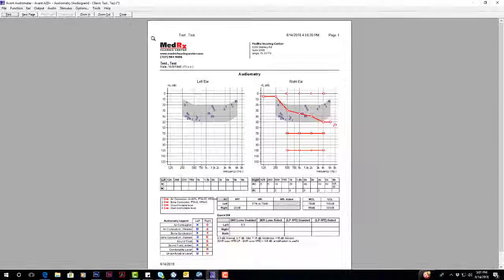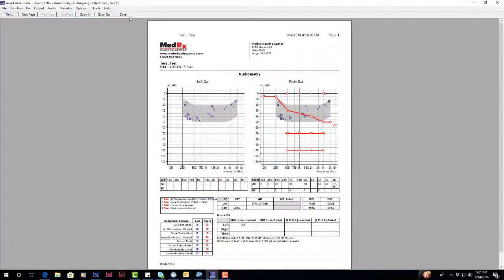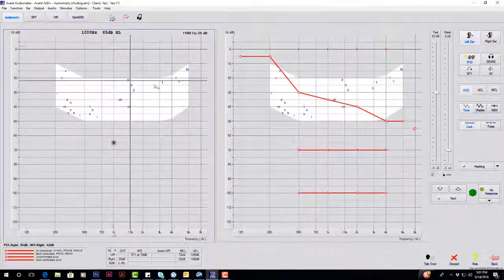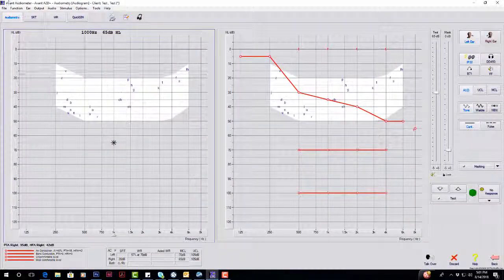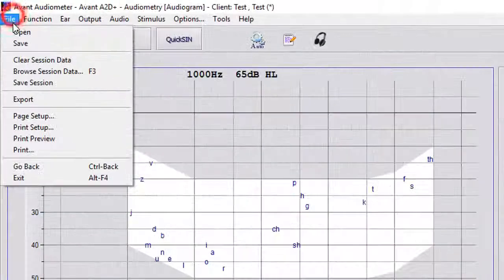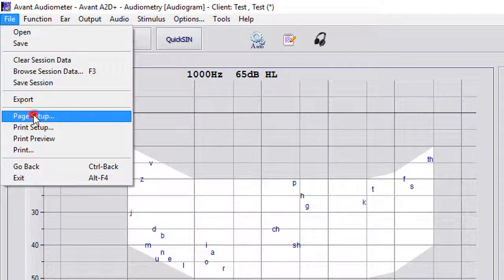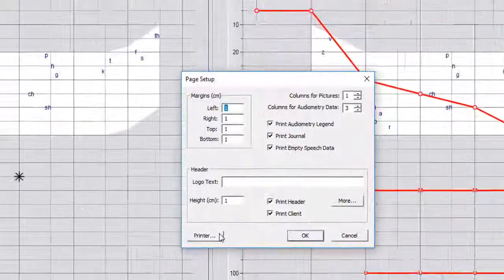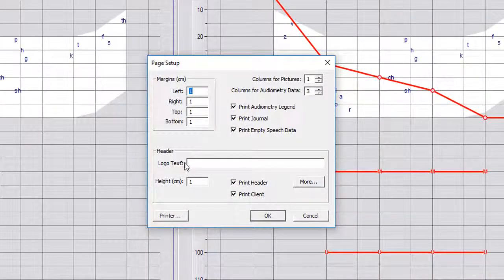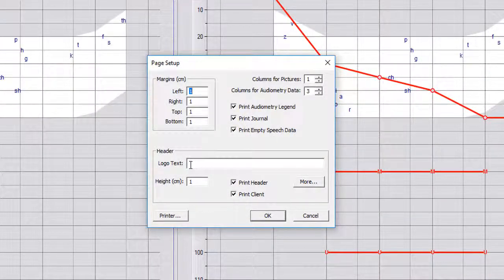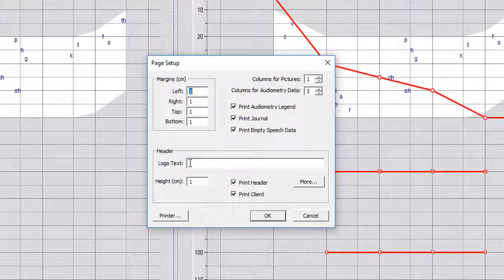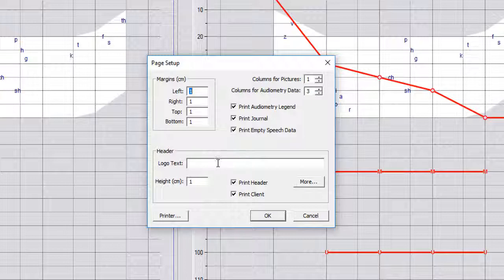So you can do that if you go from the main page here. You can go to file page setup. You can actually type in a logo text here. So some providers will put this as their name or maybe a holiday.